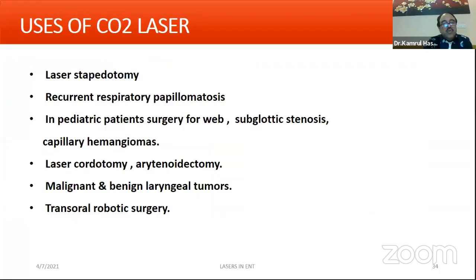In otolaryngology, especially in otology, laser stapedotomy is helpful, because sometimes with a postoperative fenestration, the carbon dioxide laser in scanner mode makes it very small and the depth will be little, so the chance of perilymph fistula is less. Even if the argon laser is used, there is a history of injury to the stria vascularis. In that case, deafness may happen. So one should think before using a laser in stapedotomy.